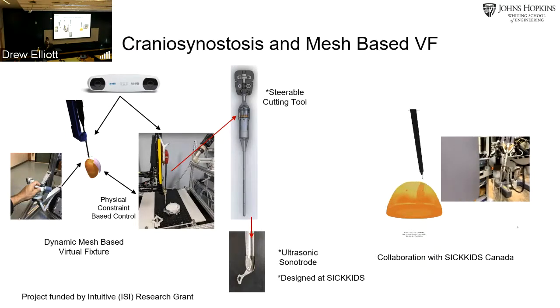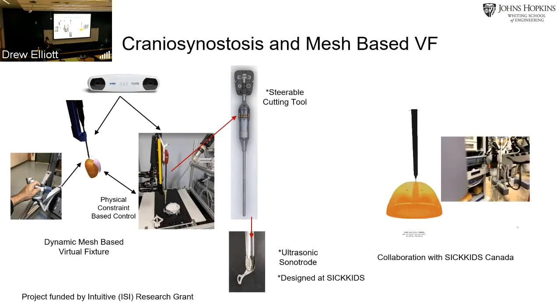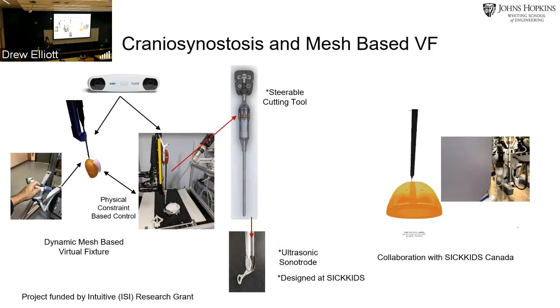And we want to take this project further so that we can register the simulated model with the real skull to do actual bone drilling. And since we're using plugins, there is very little latency, and this is being used in real time.